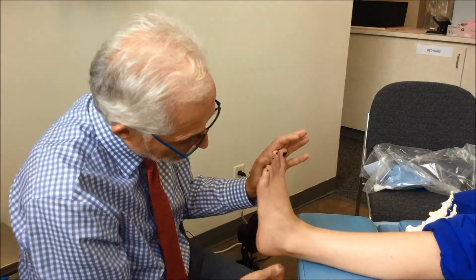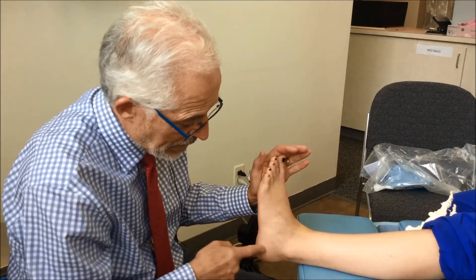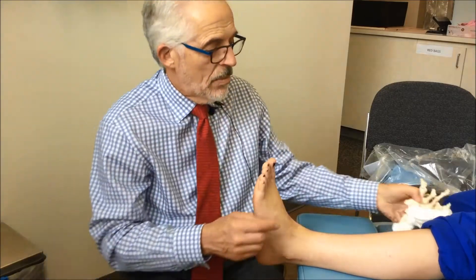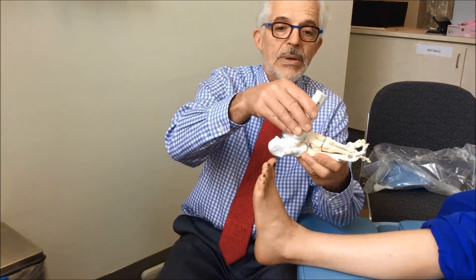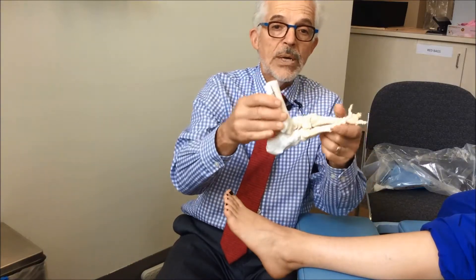When we look at the foot, we can see here that we can get this foot up to a right angle with the leg, but I'm not getting it forward 5-10 degrees as is needed for normal walking.